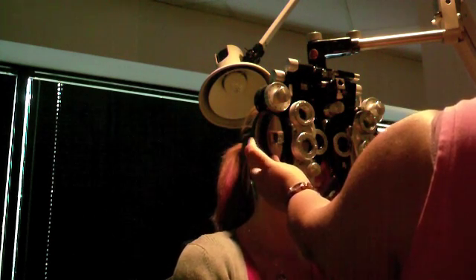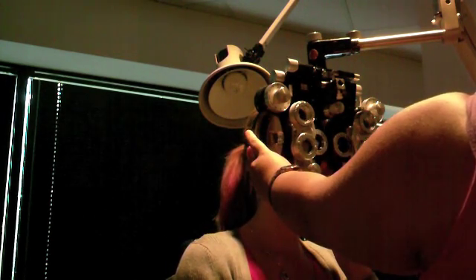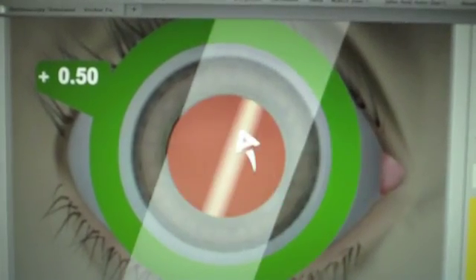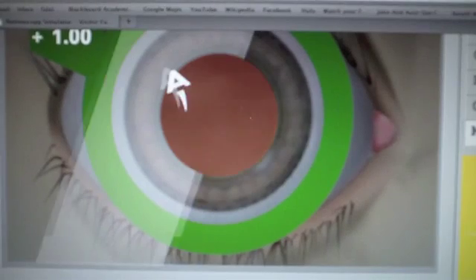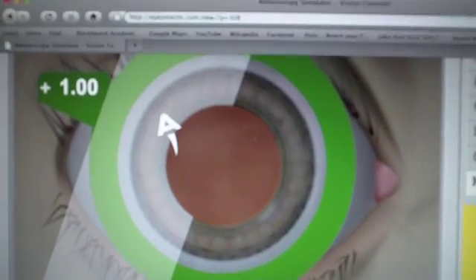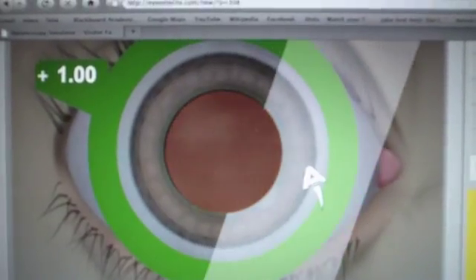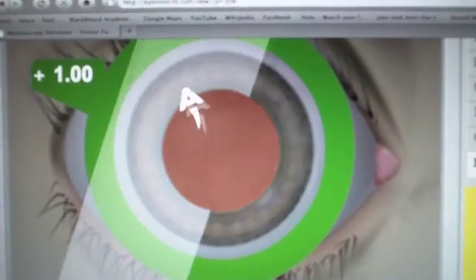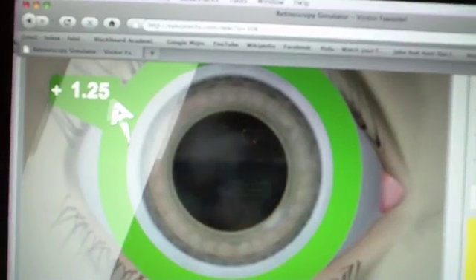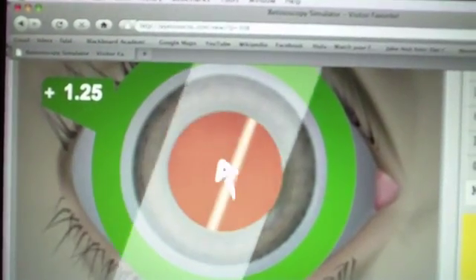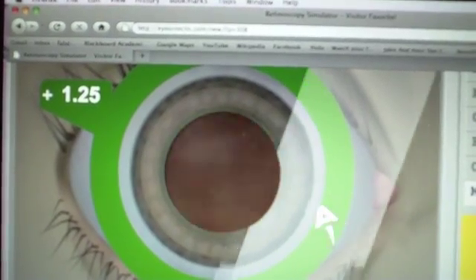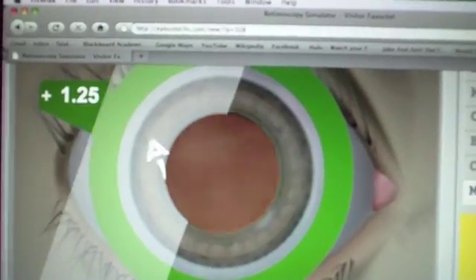Once everything's lined up, we can start putting lenses in front of the eyes to neutralize that motion. First we start with the sphere lenses, which are on the side. You add plus lenses if the lines are going in the same direction, and minus lenses if they're going in the opposite direction. In this case we used a plus lens — first I tried a plus 0.50 to see if it would neutralize it, and it didn't work. So I went up to plus 1, and now it looks like it is neutralized because there's no motion in the streak inside the eye. I'll go a little higher just to make sure — at plus 1.25 the streak is going in the opposite direction, so we went too far. So we go back to plus 1 and keep it there.